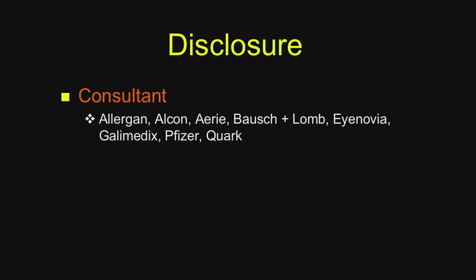So let me try to wrap up what you've heard this morning and try to put it all in perspective. Sanjay Asrani said earlier that nerve fiber should agree with the optic disc, which should agree with the macula, which should agree with the visual field.